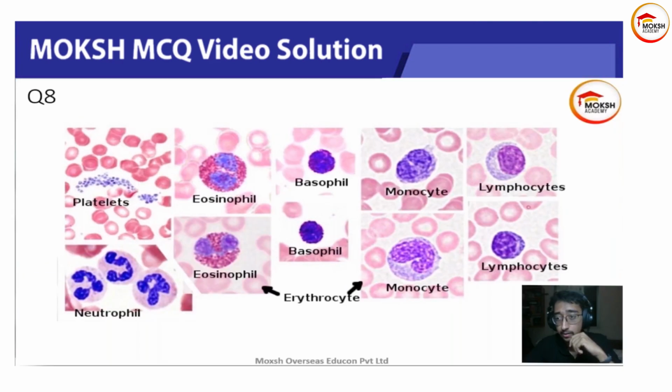Okay, right. So here are the platelets, small blue tiny things here, right? Eosinophils. You'll see that the cytoplasm has dark pink granules. Dark pink color is basically eosinophilic color, right? So that's why they're called eosinophils, because they have these pink colored granules inside. Basophil is bluish in color, completely. It has bluish granules, and they're so dark that you can barely see the nuclei.